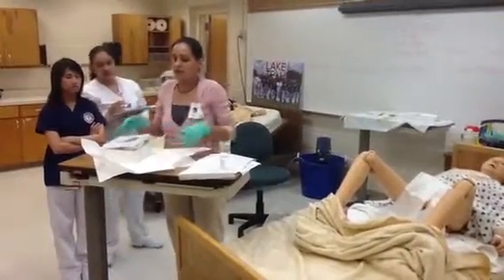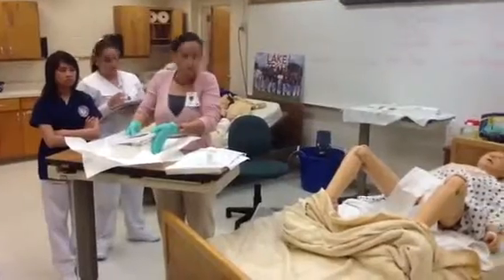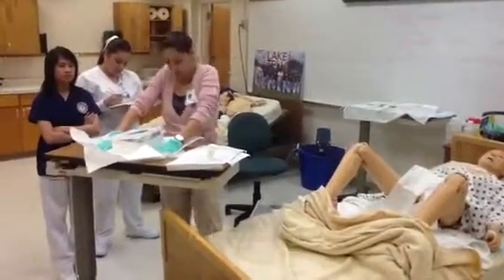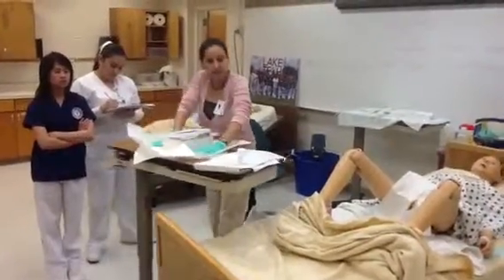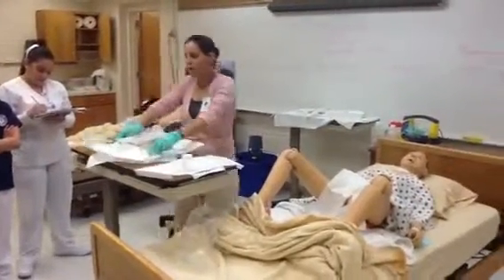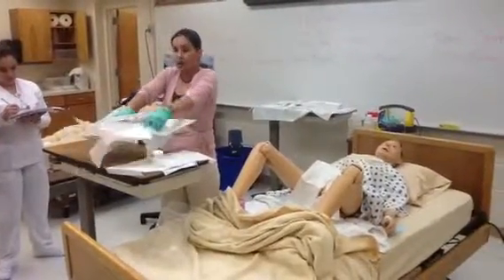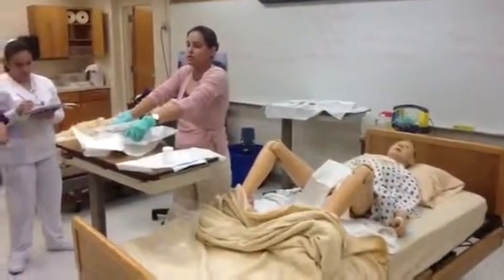Okay, so the next thing that I can do is bring my box down closer to my patient. I can move my table into a position that's good for my patient, or I can take this entire sterile field, not reaching under, but reaching above, and manipulate it next to my patient. Okay?